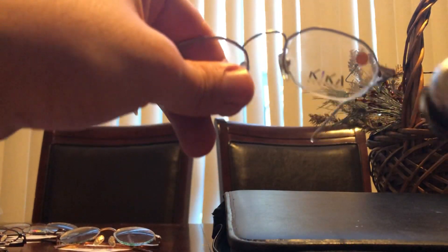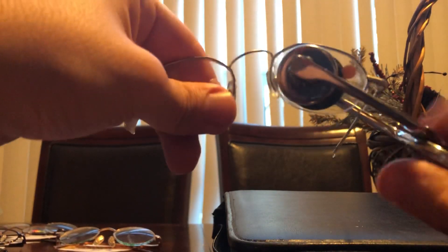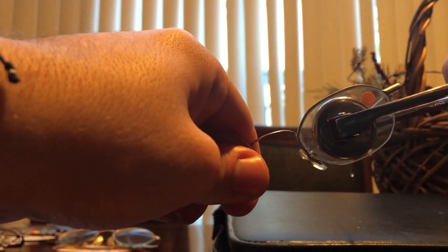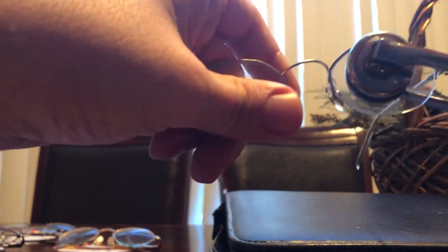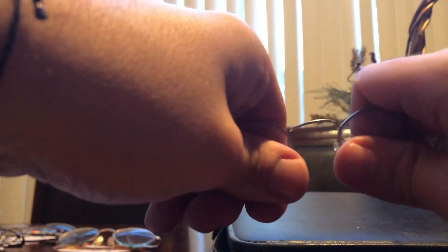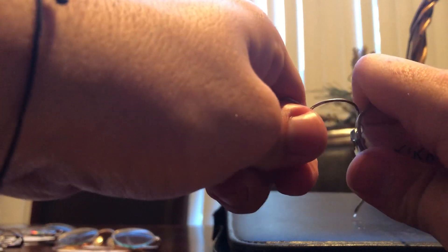To fix this, you're going to first grab the lens access plier and you're going to grab the lens and rotate it until the tops of the lenses are parallel. Then you're going to push the lenses in opposite directions, one up and one down, until the bridge is aligned.